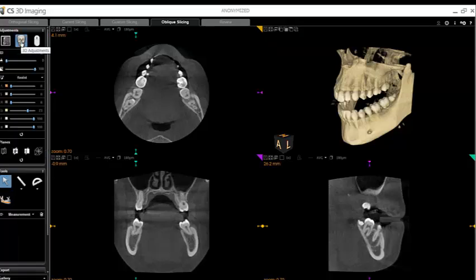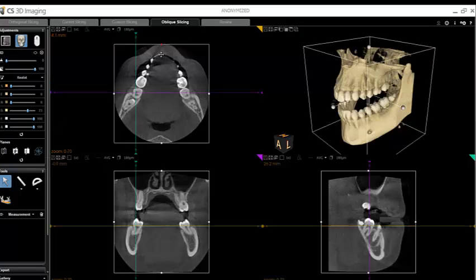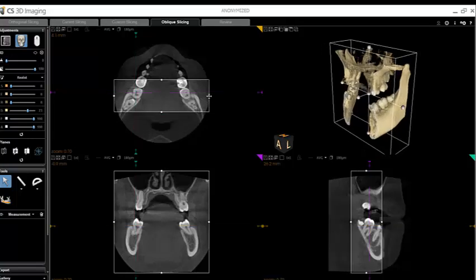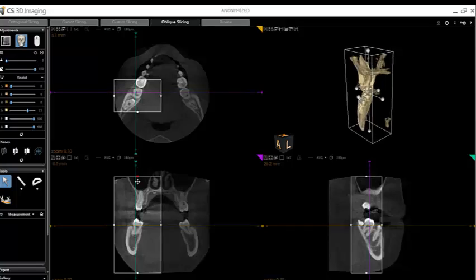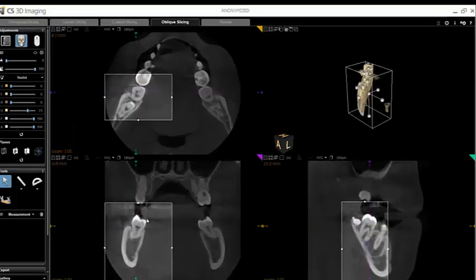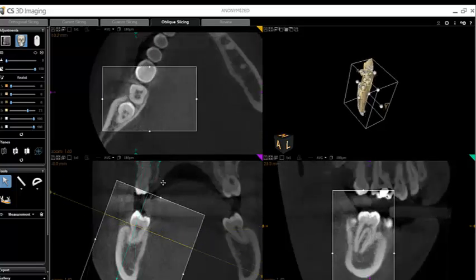Under Adjustments, click to open the 3D Adjustment tool. And then under Planes, click to display the cropping box. This will allow you to isolate your region of interest. Now, click on Mouse Settings in the upper left under Adjustments to change the setting for your mouse wheel from Slide to Zoom. Scroll with your mouse wheel to zoom in on your region of interest. You can now rotate the planes of the multiplanar views using the smaller grab handle within any plane.